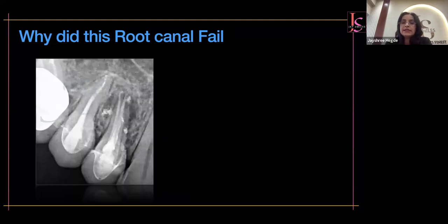And then you have this root canal treatment. And you can see the root canal treatment done here is very good. You have multiple areas of sealer puff present over there. And I think after a year, there was a failure. And what do you see here? You see a lesion on the lateral aspect of the root.